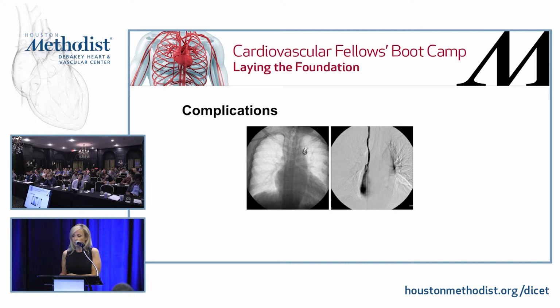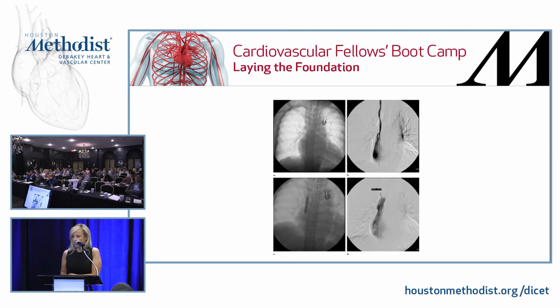If you access this vein from a femoral vein approach, you would not get into this channel. It would actually be very hard to get into that channel. So you could come up from that direction and you would avoid this. But really the way to treat this is to do balloon angioplasty. You balloon that fibrin sheath.